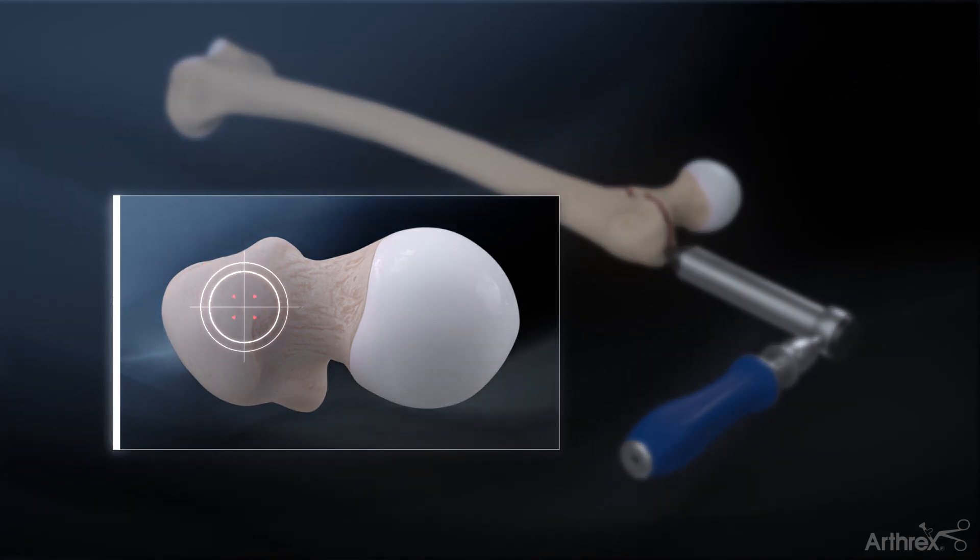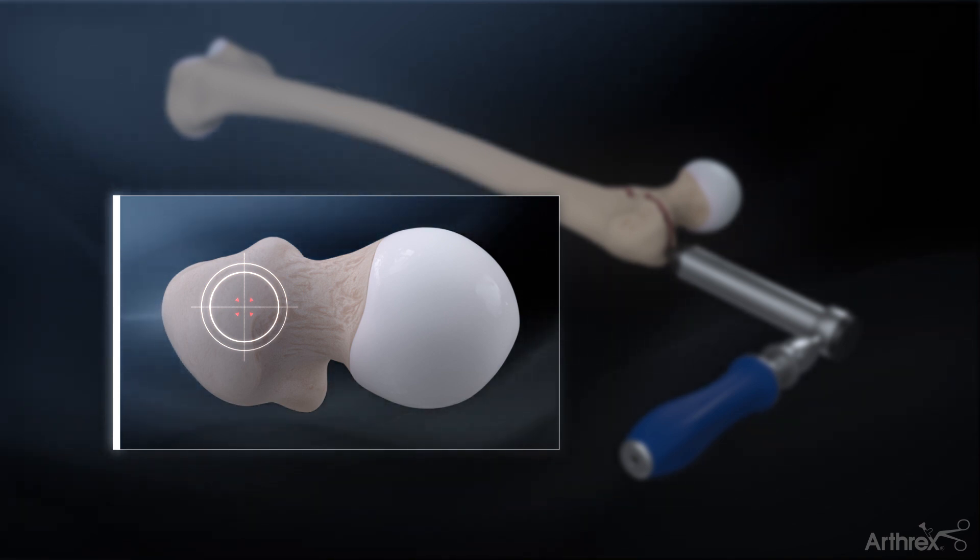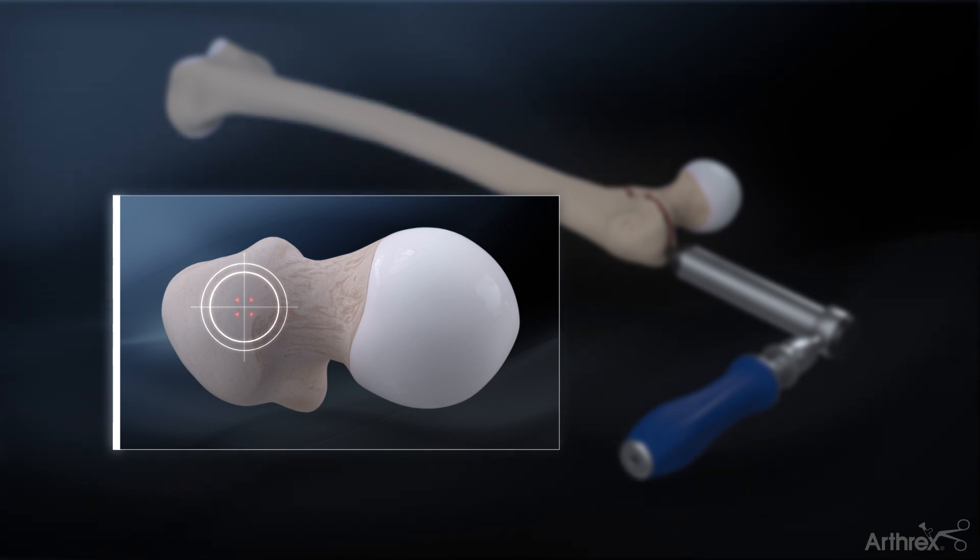The entry point for the nail is typically at the tip of the greater trochanter on the AP X-ray and at the junction of the anterior and middle third of the great trochanter on the lateral X-ray. This point may vary slightly depending on the patient anatomy and fracture pattern.